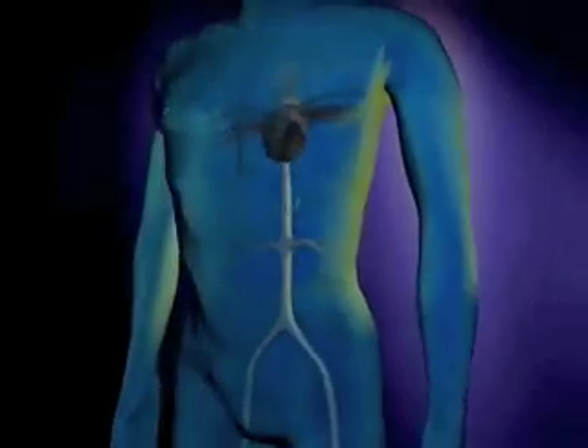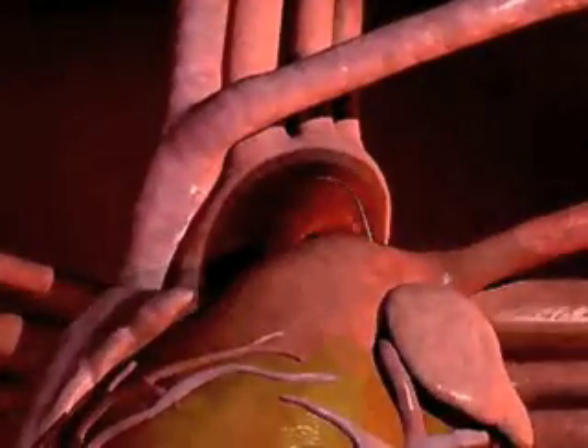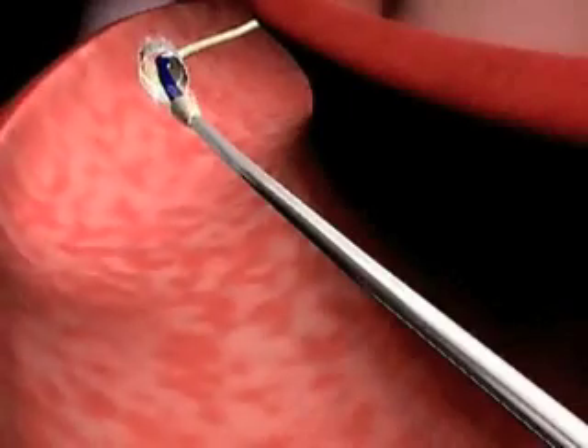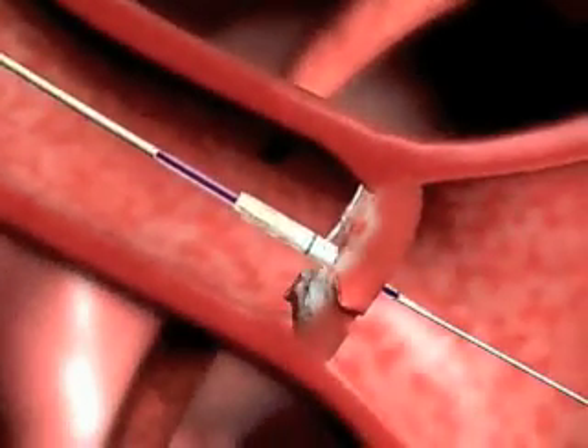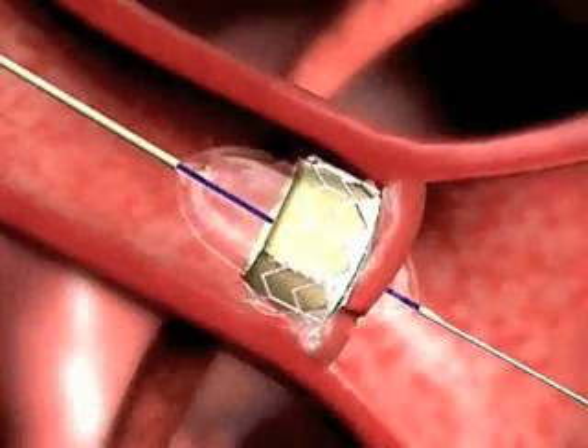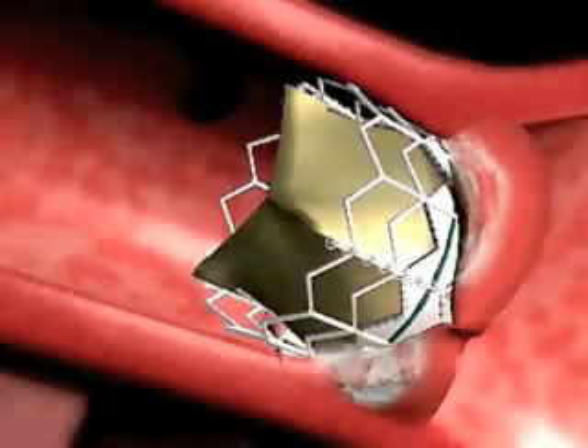The catheter is introduced through the femoral artery and threaded up over the aortic arch. A balloon is inserted into the native valve and inflated to open it. A new balloon catheter pre-mounted with the transcatheter heart valve is then placed and inflated. That catheter is removed and the transcatheter valve is now replacing the native valve and functioning.